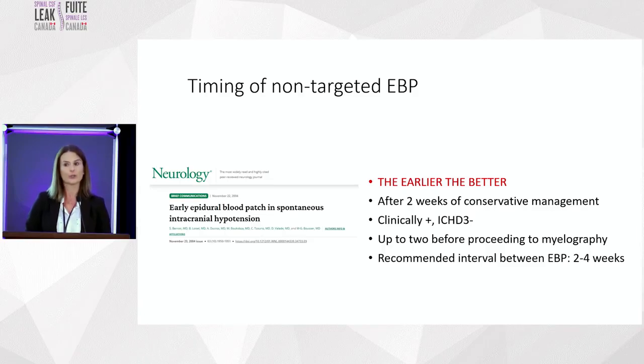The timing of the non-targeted epidural blood patch is very important, and we know now that it must be done the earlier the better, because it really improves our outcomes in the long run. So usually after 2 weeks of conservative treatment, you should be offering your patient a non-targeted blood patch, even if the patient is only clinically suggestive.